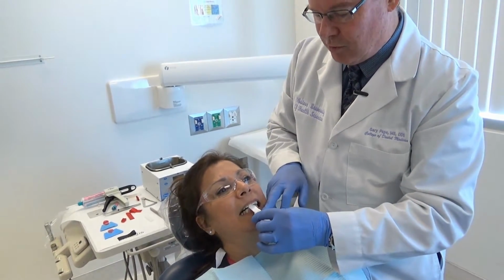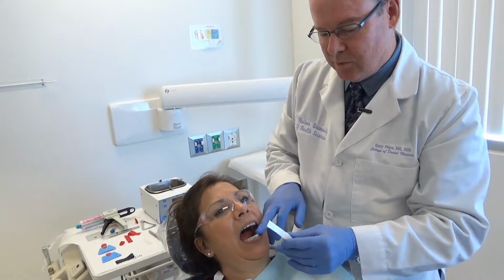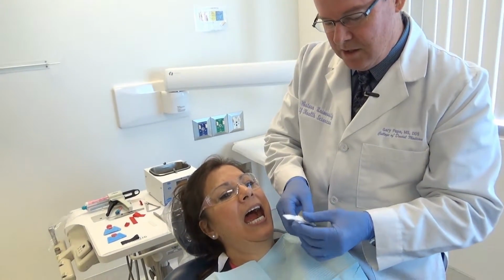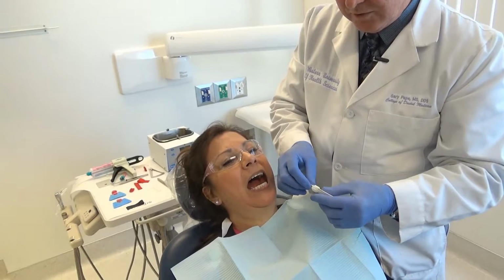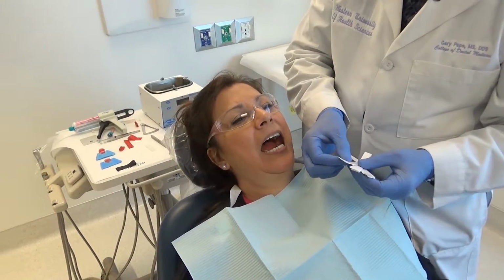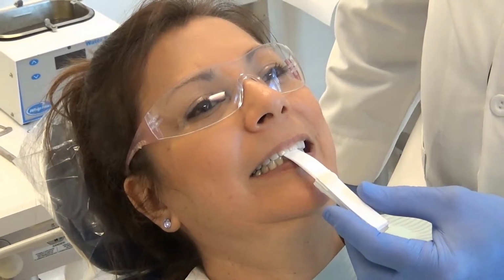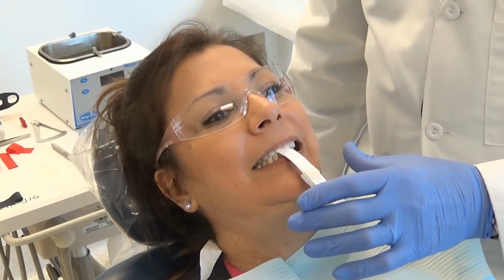Okay, open, stay open. Now I don't want her to be biting on any teeth when I take the record, so I'm going to add a couple of leaves back. So I'm going to take maybe 1, 2 leaves and put them back, and close. Do you feel yourself touching anywhere? Mm-hmm. Okay, good. So at this point, she's not touching any teeth.